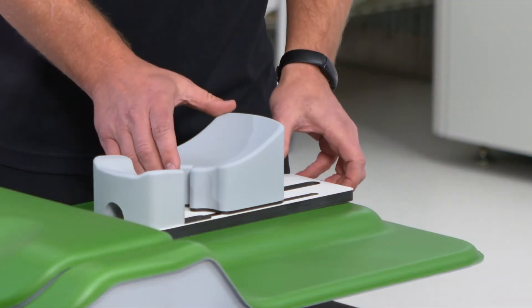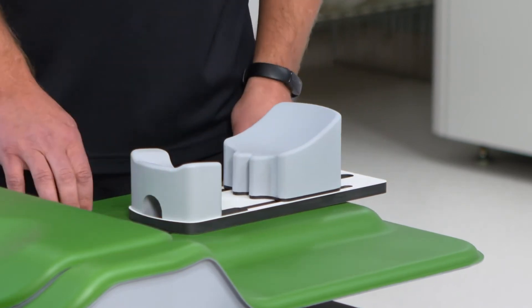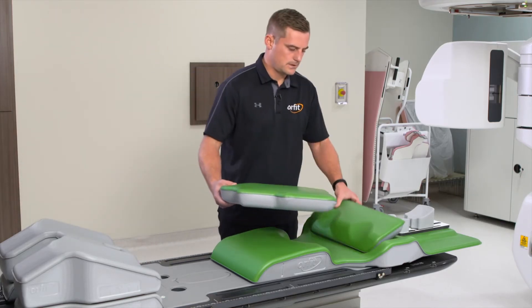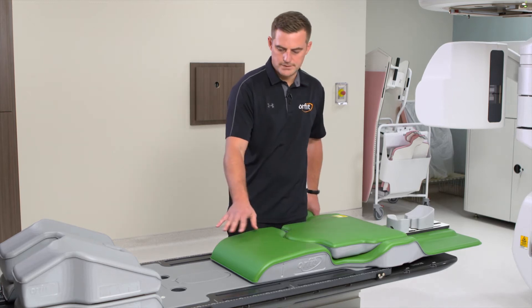It has seven different forehead positions, as well as three different indexing positions on the prone bellyboard, and the comfort cushion to fill it in. You can also have another option to fill in the hole gap here for any kind of prone setup that you need.